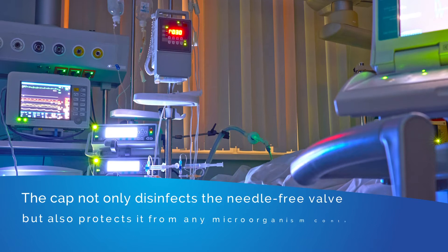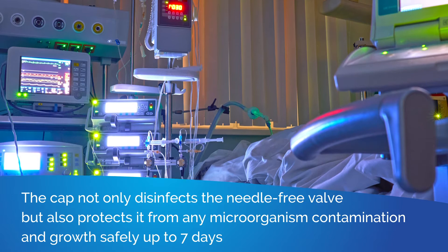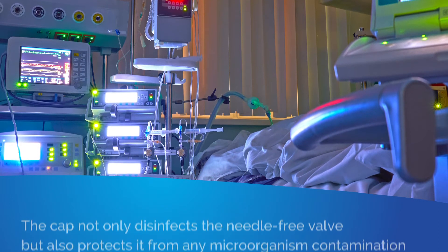The study also showed that SwabArt not only disinfects the needle-free valve, but also protects it from any microbial contamination and growth safely for up to seven days.